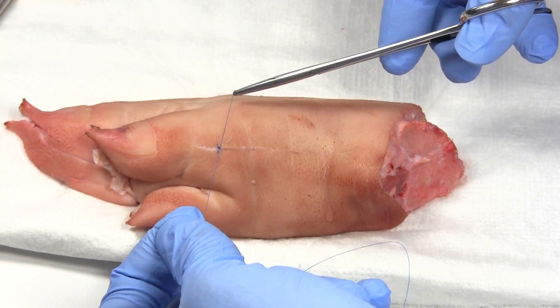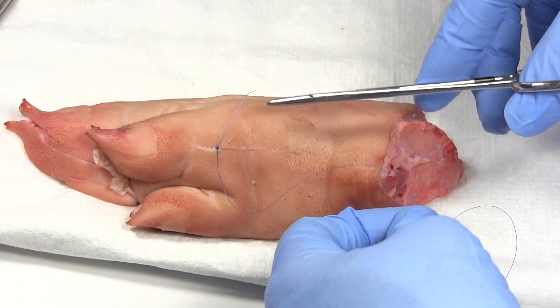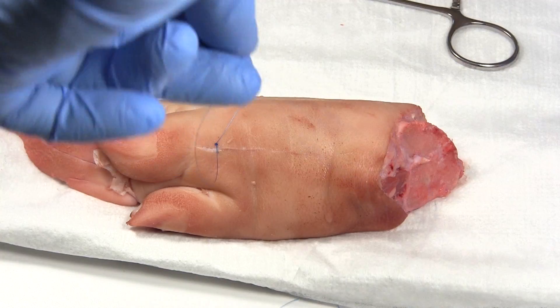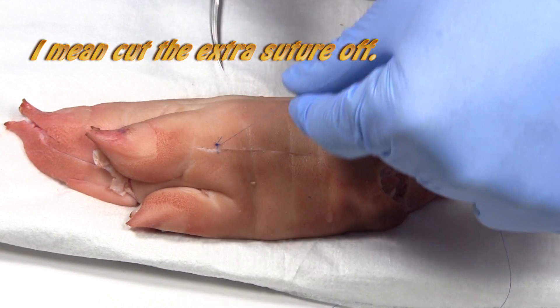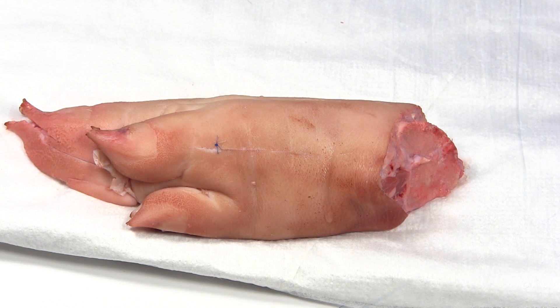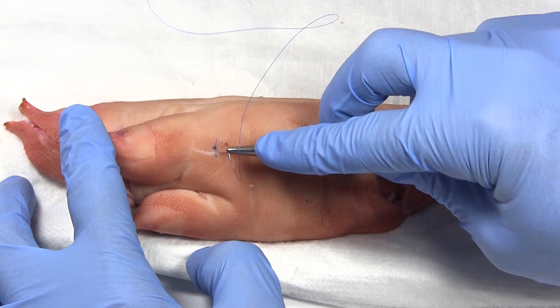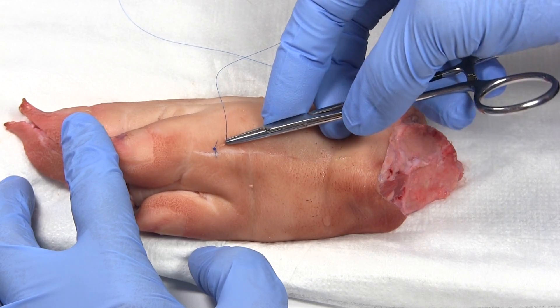After you're done, you can see the laceration and wound edge — you don't want that knot right over the wound edge because it will cause irritation. Simply tug it over to the side. Then take your iris scissors and trim off the ends, but leave a little bit of a tail so that when you or someone else goes to remove the sutures, you can get to it more easily. If there's no tail, it's harder to pull that knot up.